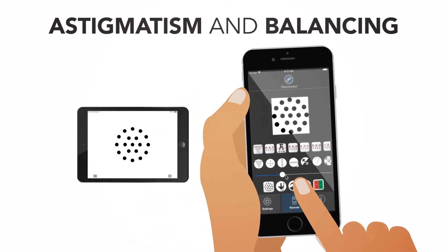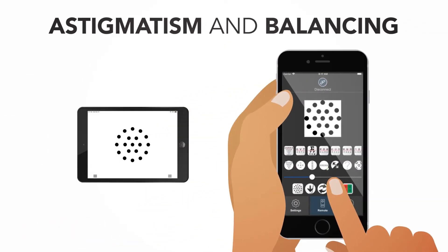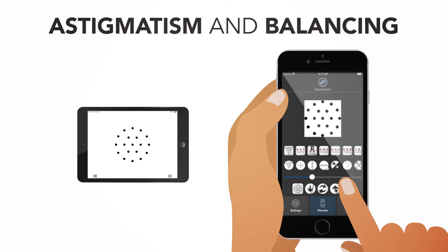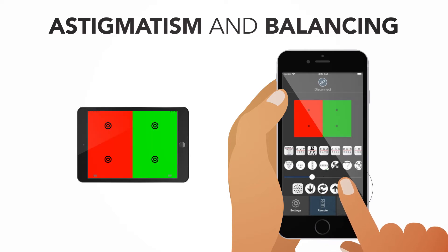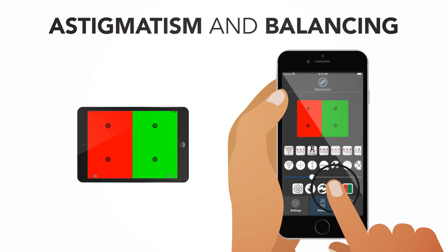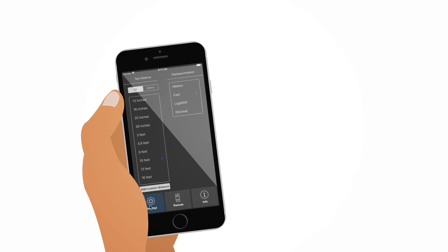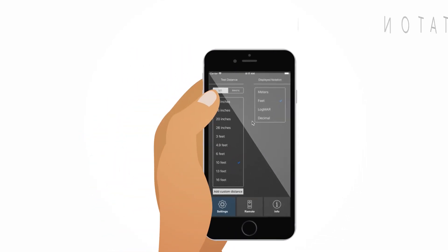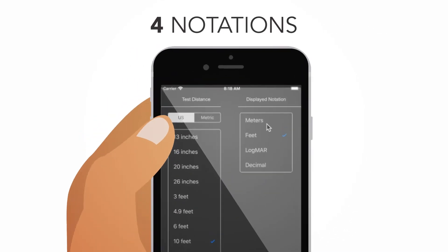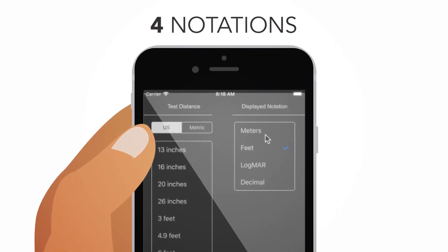Switch to the astigmatism and balancing charts to finalize your refraction. Set up your charts to display your preferred notations on the side of the chart.